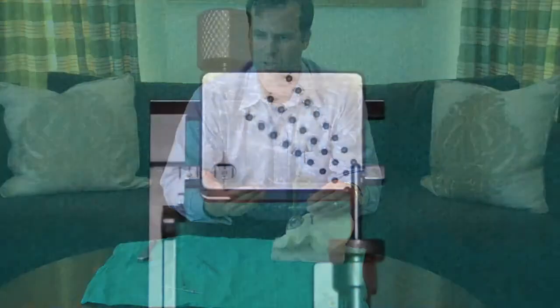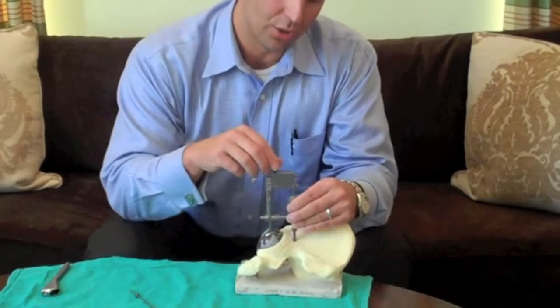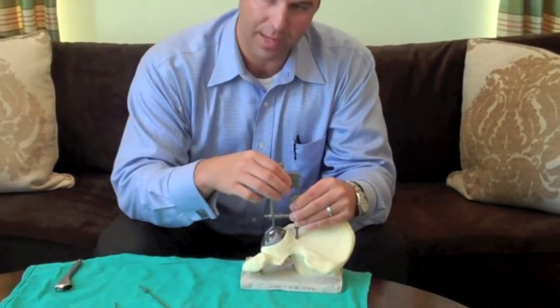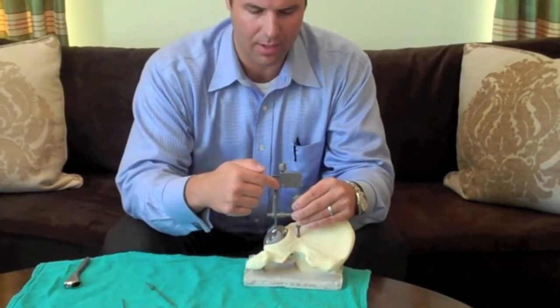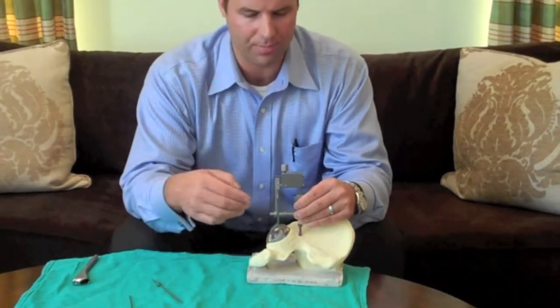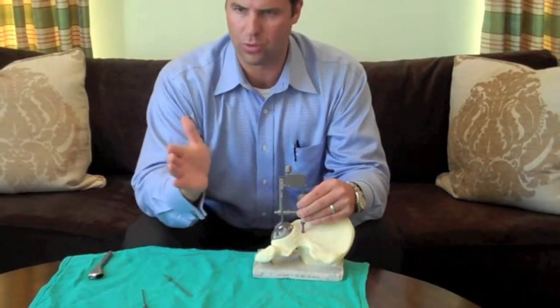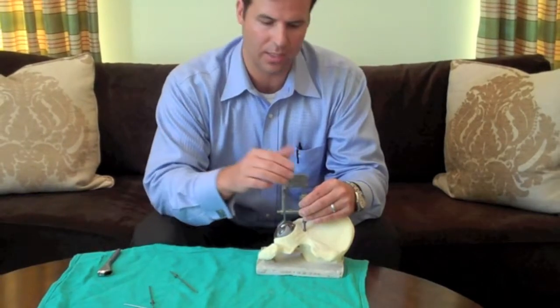For instance, if the surgeon really wanted to use a varus neck with a short head, the surgeon could loosen the set screw and move this measurement plate to where the tip of that stylus corresponded to that particular dot, and then read off the window there how long they were lengthening or shortening the patient. The surgeon could then either accept that change in leg length or try to change the broach position, the ultimate femoral component position, to make up for that change in leg length.